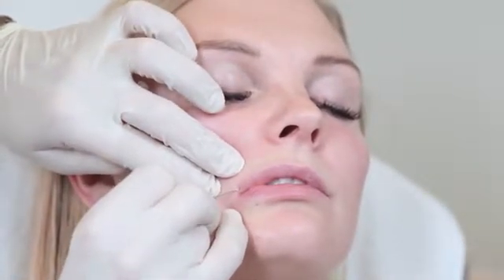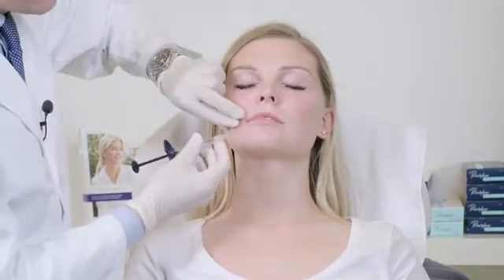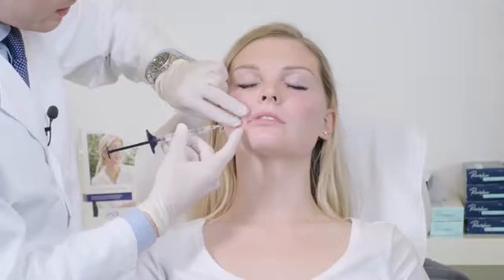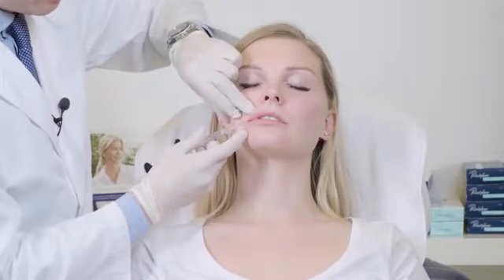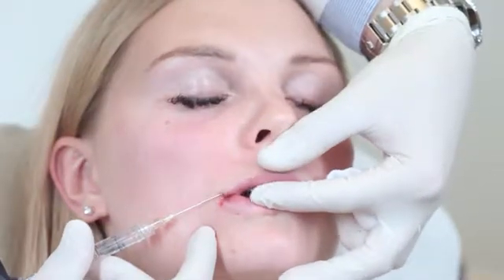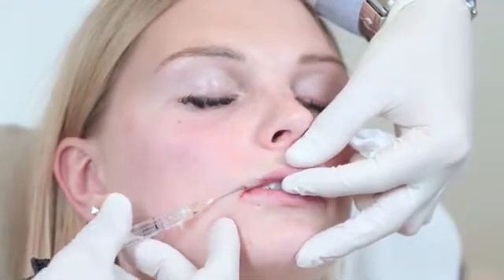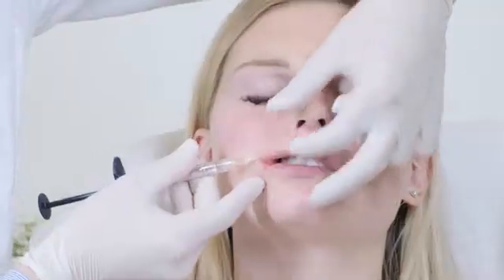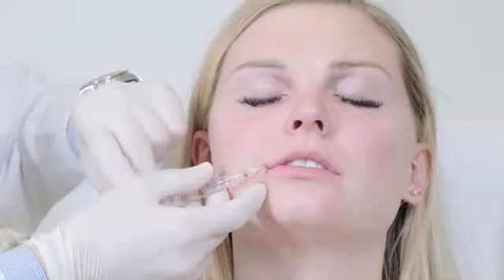I simply pierce through the skin. I prefer a 25G cannula because it is a bit firmer and easier to guide through the tissue, but if you prefer 27, that is just fine as well. When treating the lip with the cannula, it's important to use both hands. Use your non-dominant hand to straighten out the tissue to create a horizontal plane for the cannula to glide on. This reduces patient discomfort. Personally, I prefer to inject the mid of the lip rather than the vermilion border. It gives a more natural look to the lip.